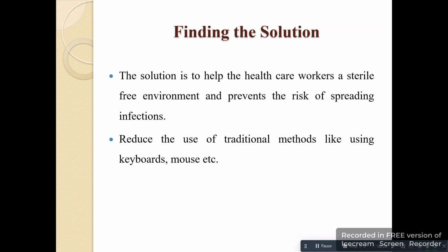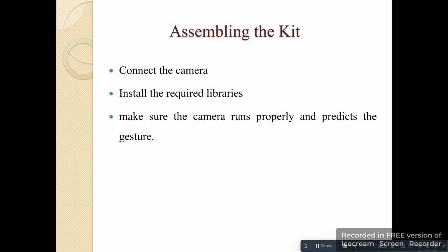Finding the solution. The solution is to help the healthcare workers have a sterile-free environment and prevent the risk of spreading infections, and reduce the use of traditional methods like using keyboards, mouse, etc. Assembling the kit. First, we have to connect the camera. After connecting the camera, we have to install the required libraries, such as image processing libraries used for machine learning, artificial intelligence and machine learning. Make sure the camera runs properly and predicts the gesture.